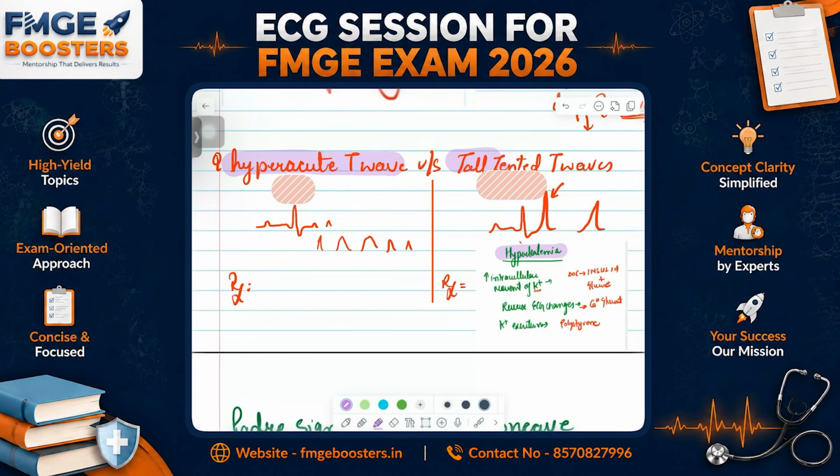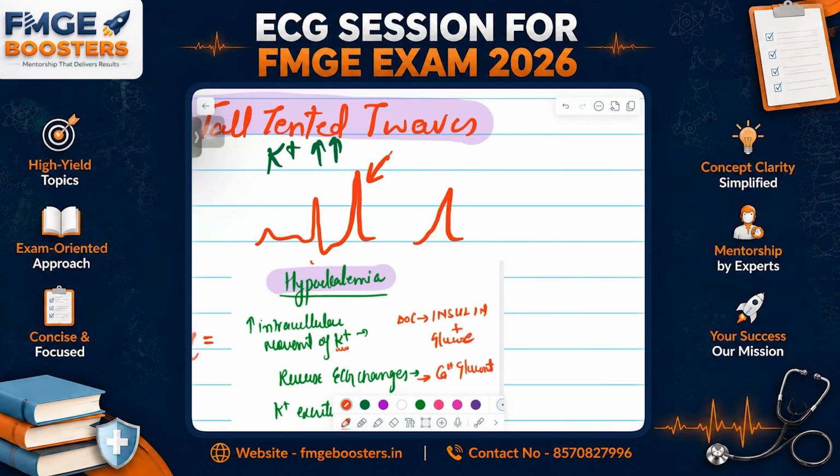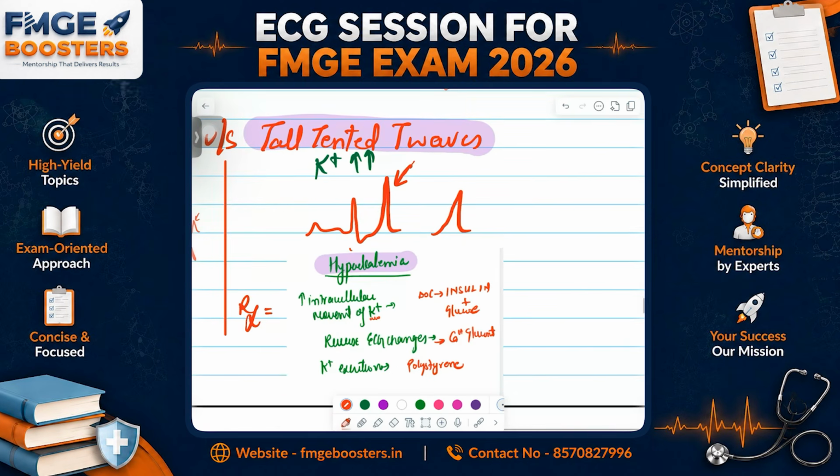Now we are doing the difference between hyperacute T wave and tall tented T waves. Let's do the difference. You already did. Hyperacute T wave is the first change in myocardial infarction, whereas tall tented T wave is seen in the case of hyperkalemia. Hyperacute means it is a very acute thing. Suddenly it is happening and it is very peaked. Okay? Whereas if it is tall, it is very tall and tented.